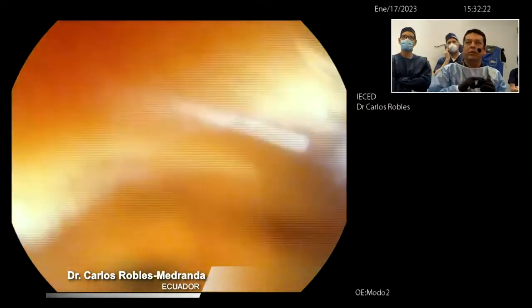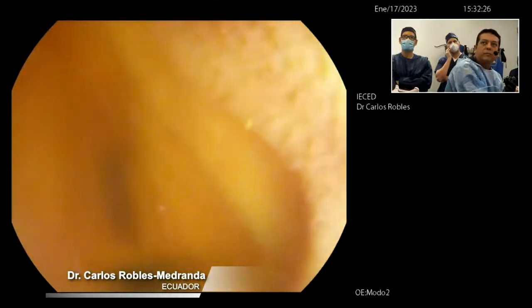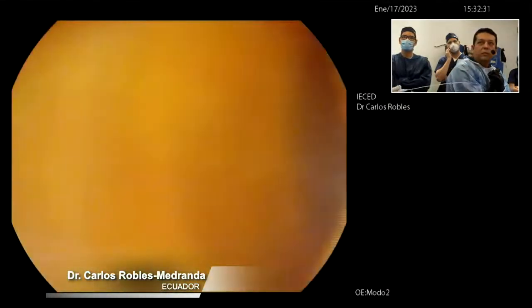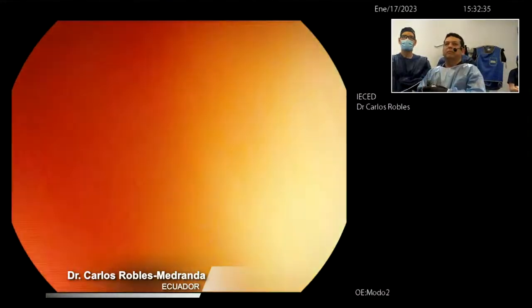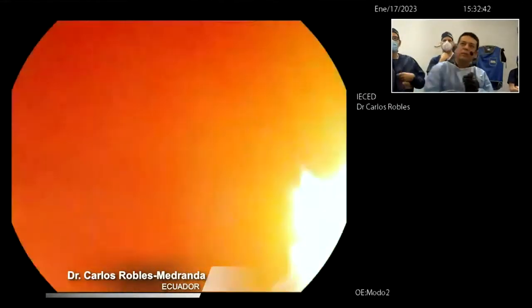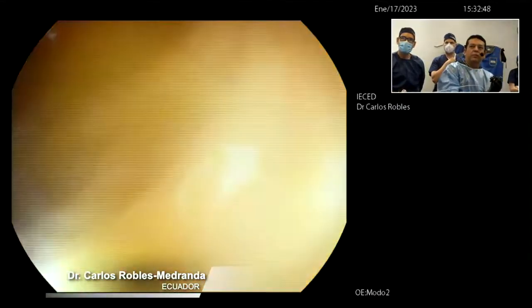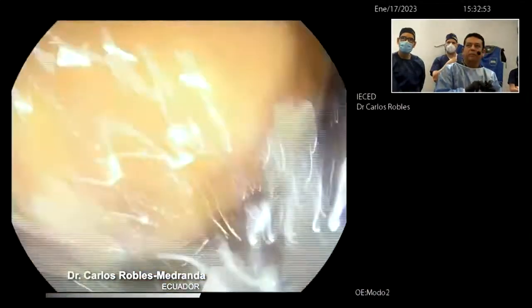So use the. It's okay. A small piece of polyp, but it's not necessary. Just to do the things right. You see the endoloop rests there very well. In the small bowel we can do it. It's okay. I will not stay like hours just to recover a small piece. Well, I will close my transmission.